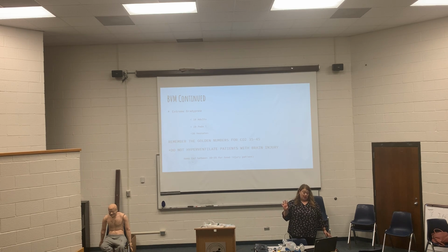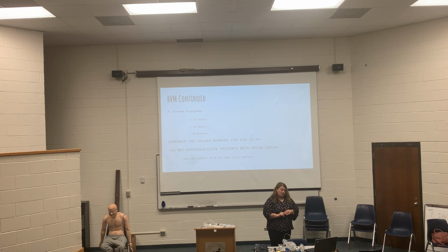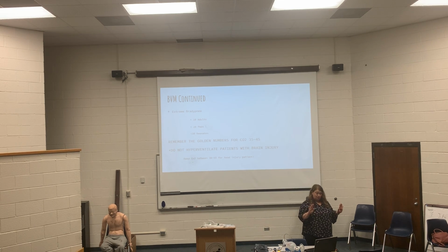But if they're breathing on their own, you want to help them, and if they're breathing shallow, when you see their chest go up, squeeze that bag a little, make sure that you see that chest rise and fall. As far as, again, that golden number, I would beat it into your head, 35 to 45.